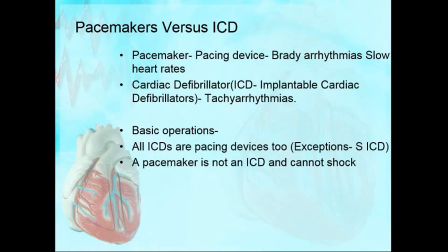You could also ask, I used to ask when I was a cardiology fellow and even as an attending, why not make all pacemakers and defibrillators together, like one combination. There are a lot of reasons why you don't do that.